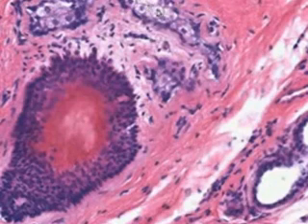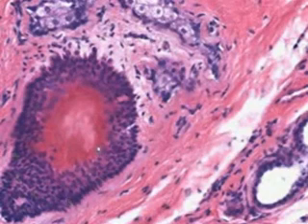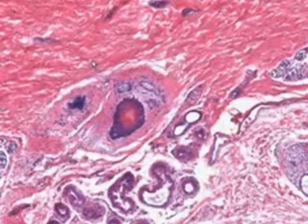On an individual cellular one-to-one basis, the sebaceous gland cells look a lot like eccrine sweat gland cells, but they are in sheets. You could see perhaps a whole sheet of them, whereas the clearish cells of the eccrine sweat gland are never more than 1 or 2 cells thick. So here is a portion of the hair. Here's the hair follicle, and here are some sheets of sebaceous gland cells, which of course all have to open into the hair follicle. And I think we could probably see a better one somewhere else down the line.